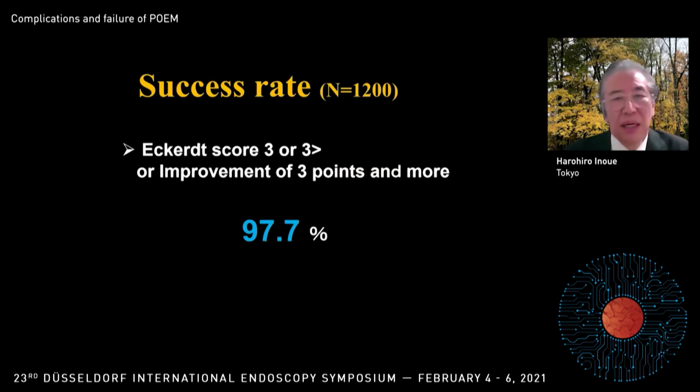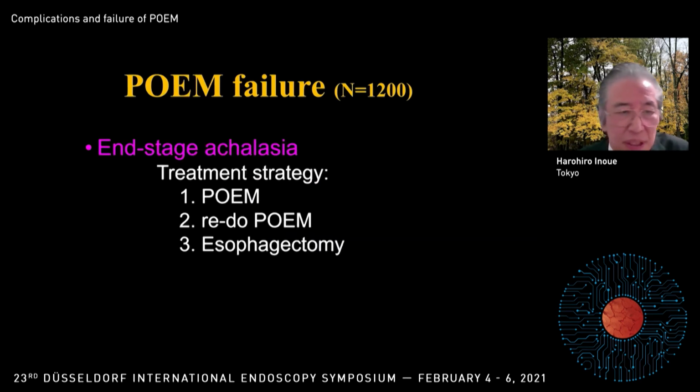So finally, I'd like to mention the failure of the POEM procedure. End-stage achalasia, even end-stage achalasia, we have to perform POEM. Some of them work, but in some cases it doesn't work.